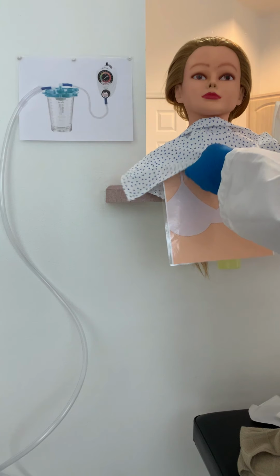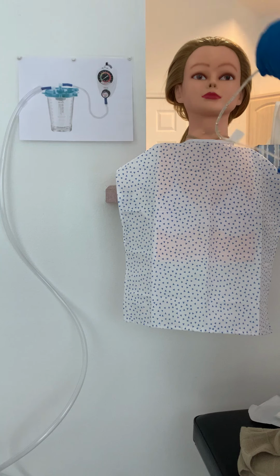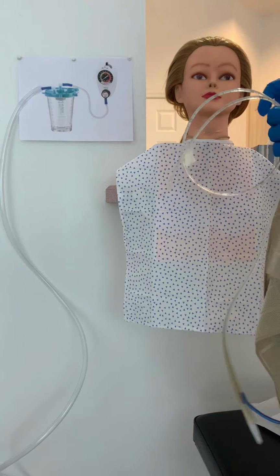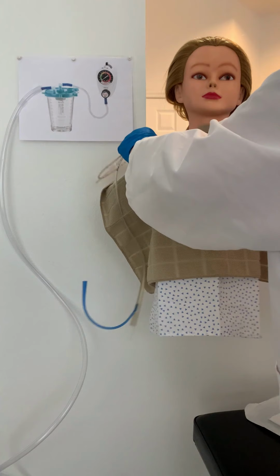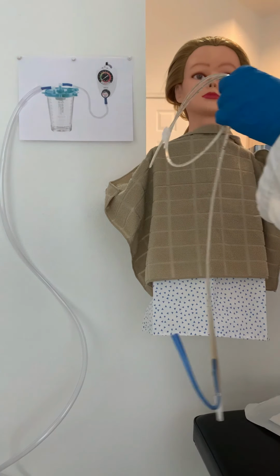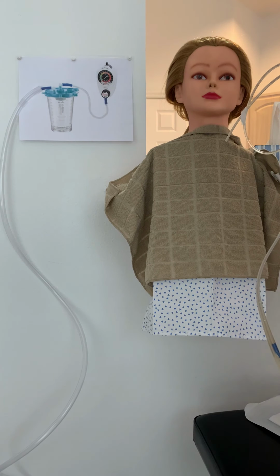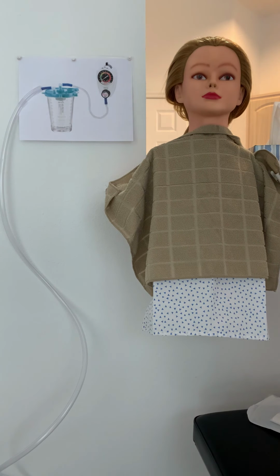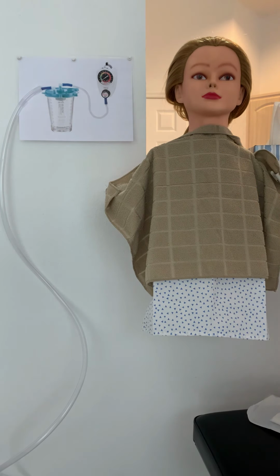Okay, now we can put this gown back down, and then I'm going to put a towel over your chest as well. Just in case we make a mess. All right. So now we are ready to start inserting. Before we insert, we are going to dip the tube in our lubricant.